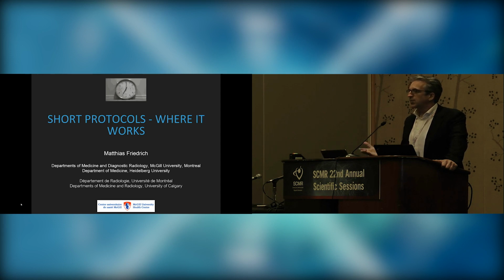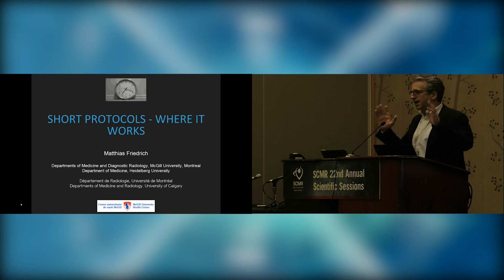And we know one of the roadblocks of CMR in clinical application has been the opportunities we have with CMR, this rich range of methods we can apply that have also been a curse to us, because for many the impression was, yeah, CMR is this technology where you can basically do everything you want, but you need a lot of training, your tech has to be a specialist, and you have to have an expensive machine. It takes an hour or two for the patient to get done. Then you have a slew of images and data, and to deal with that is also difficult.